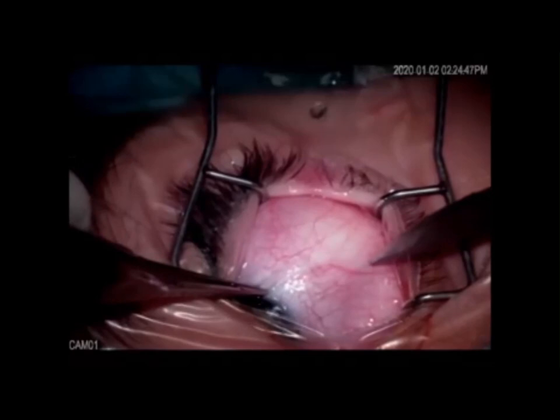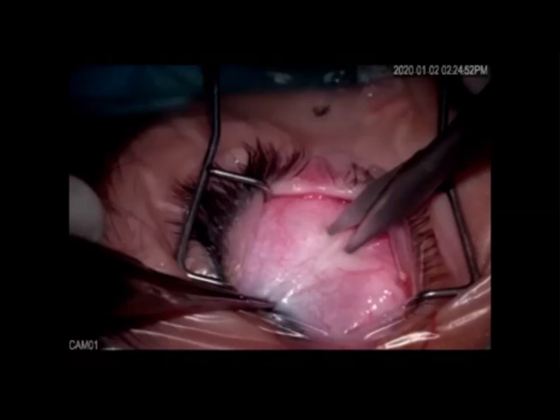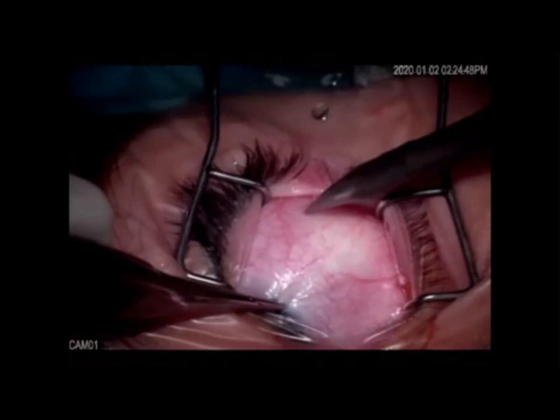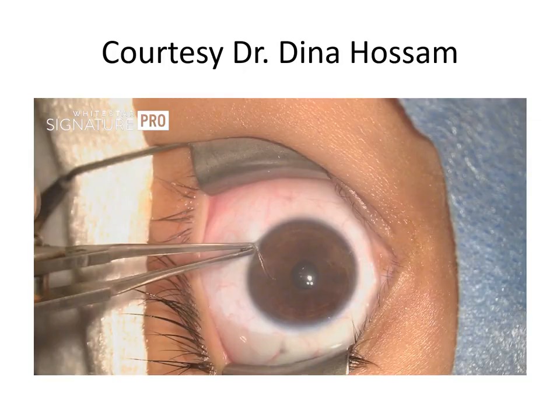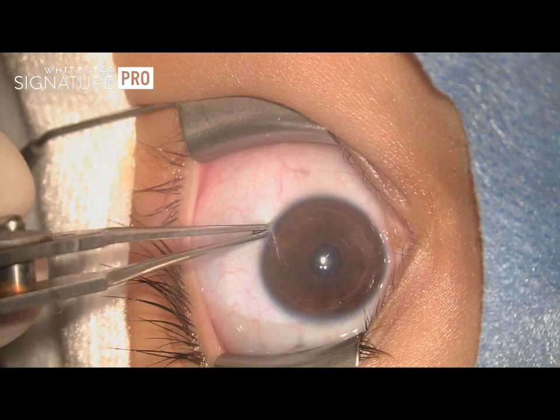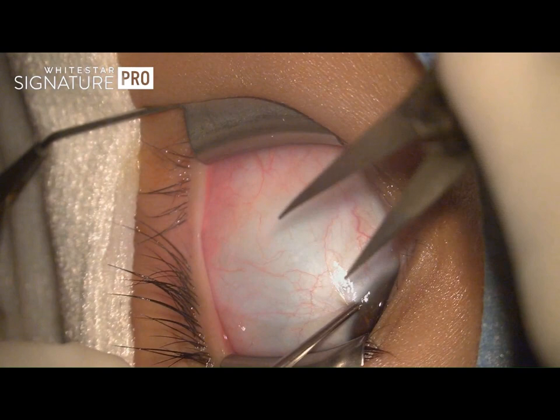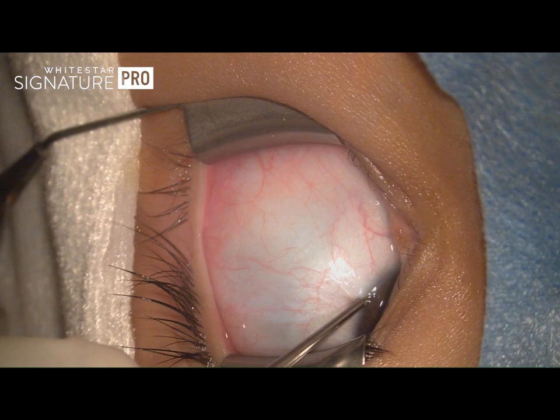In fornix incisions, the globe is grasped at the limbus using a fixation forceps and pulled in an oblique fashion to expose the oblique quadrant of the globe between the two muscles. You can see that there is a pink zone overlying the muscles and a white area in between. The incision should be made in the white area, not in the pink zone. The standard way of doing a fornix approach is to do a circumferential incision in the conjunctiva using a small superficial snip, usually about 8 mm from the limbus.